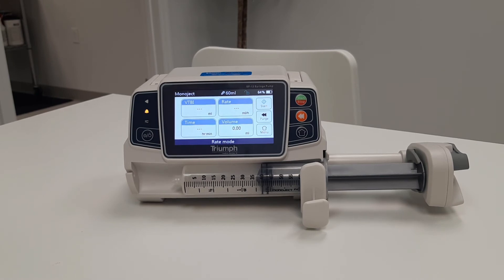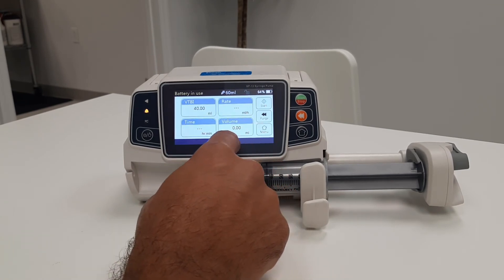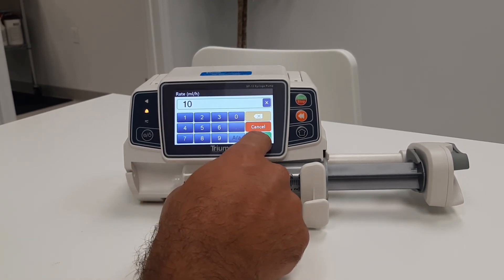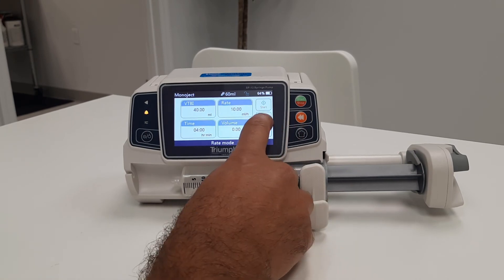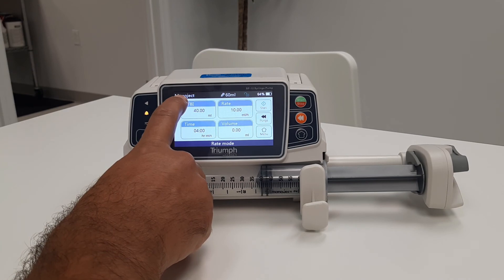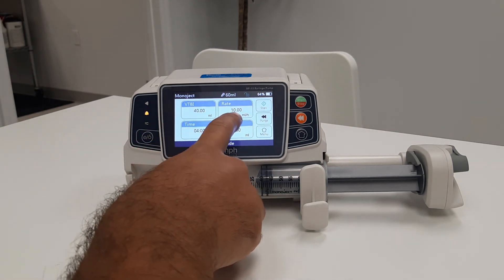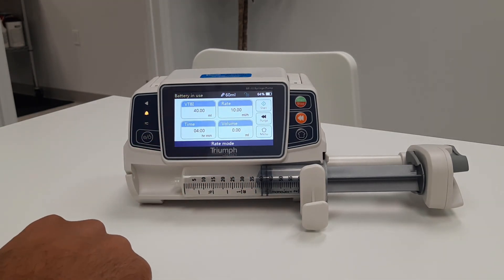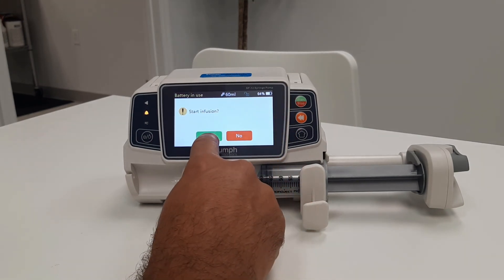Once you have verified the correct syringe size and manufacturer, you will enter the infusion parameters. Do this by selecting the appropriate boxes on the touch screen. Purge, if necessary, by pressing one of the two purge buttons. Once again, verify the syringe size and manufacturer. Verify your settings, and finally, start the infusion by pressing one of the two start buttons.